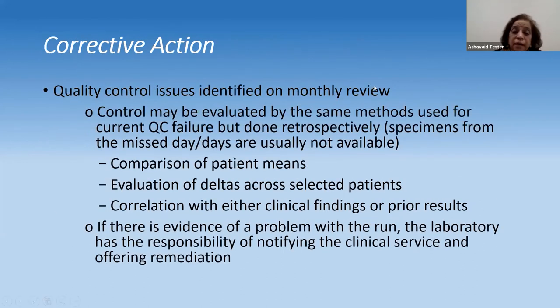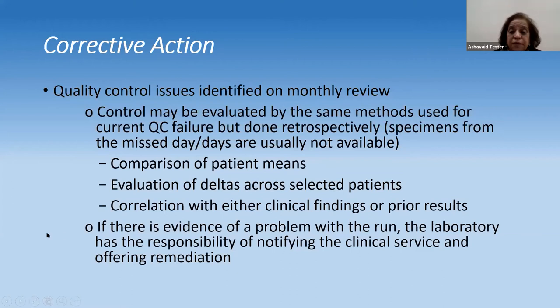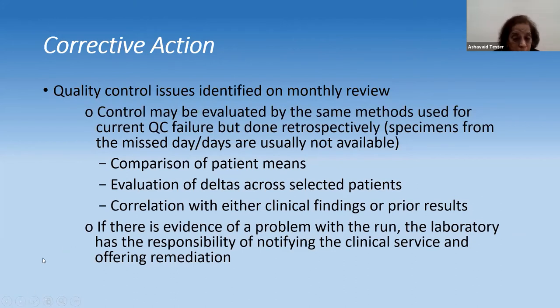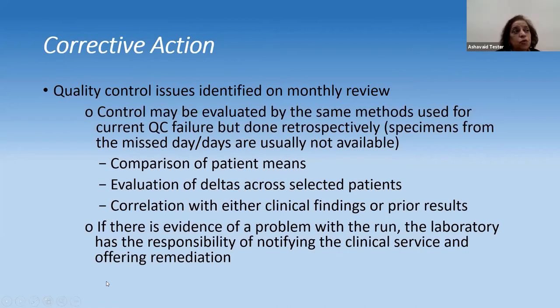A monthly review is important and must be done by leadership. Controls may be evaluated by the same method used for the current QC failure but done retrospectively — including comparison of patient means, evaluation of deltas, and correlation with clinical findings. If evidence of a problem with a run is found, the laboratory has the responsibility of notifying clinical services and offering remedy.